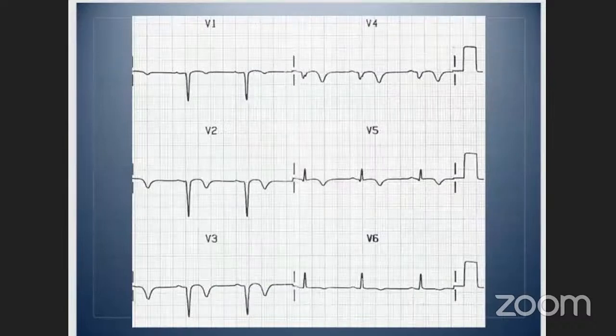Alrighty, so this is an ECG and it seems very abnormal, not really sure what to make of it. And so we still stick with our standard approach. So we know our rate, and so we're able to calculate our rate, our rhythm. This is a regular rhythm as well. And axis, this has now a sort of horizontal axis shift.